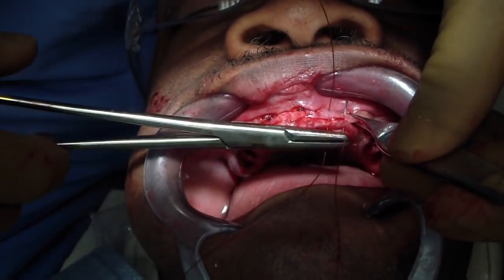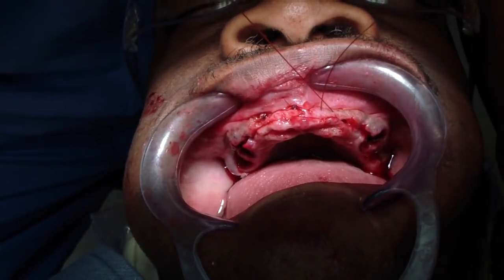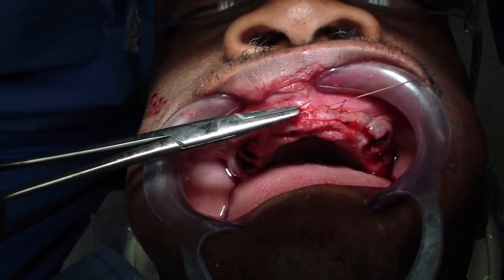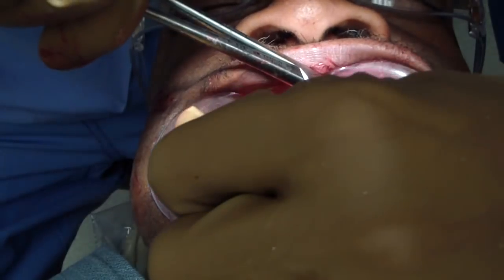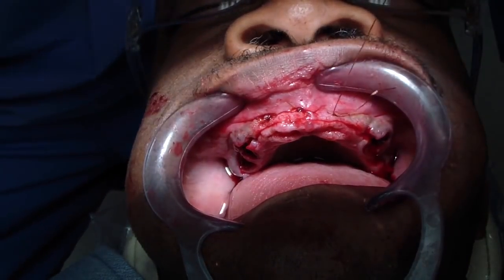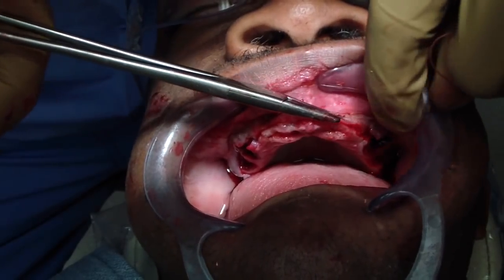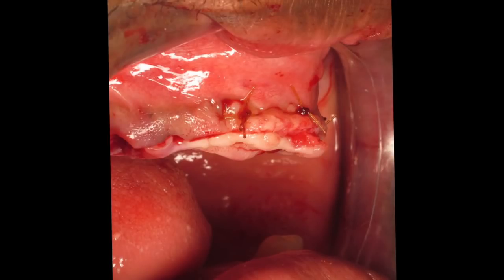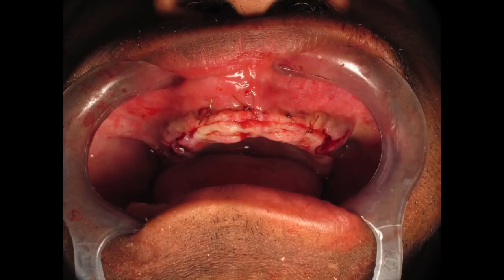Finishing off the suturing. Hopefully you can tell in the video how much less mobile the soft tissue is once we remove that excess. We're hoping to better approximate that soft tissue to the bone and speed up the healing process for Aaron. Once we're done, we're going to be delivering an immediate denture. Here's a sagittal view of the osseous crest — it's fairly hard to tell how much it's been reduced as it's immediately postoperative. And here's an occlusal/facial view just showing approximation of the tissue.